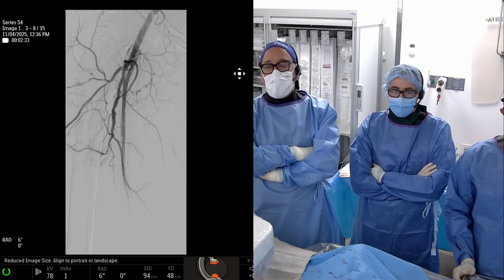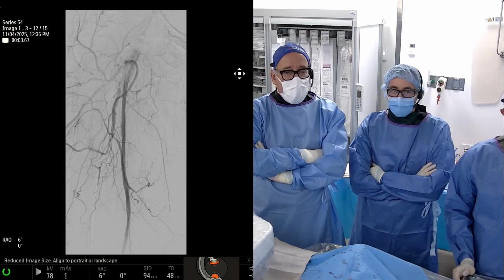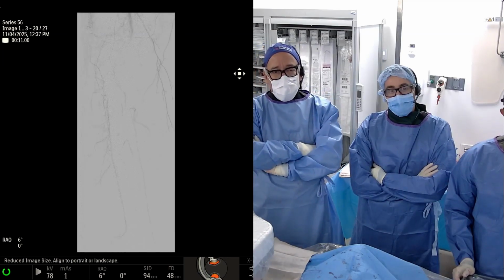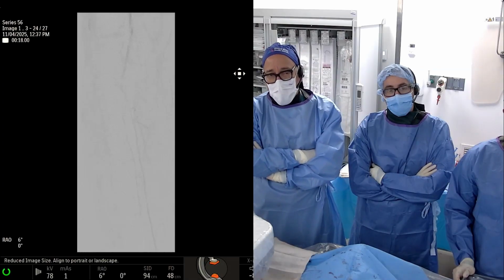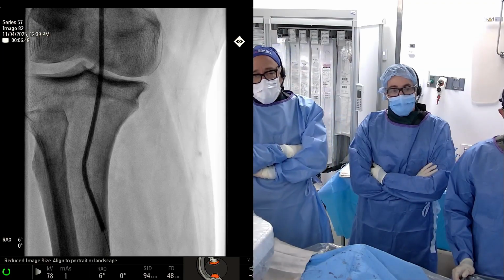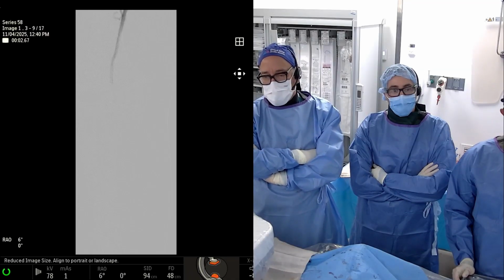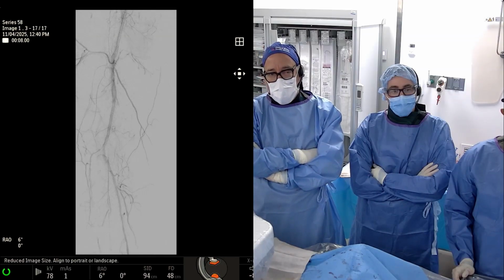Do you want to? Well, we're sort of getting there, and that's where I think is a really good conversation. So this is where we are now, where we've restored antegrade flow. There was some residual material, and so everybody on the panel who said maybe putting a filter down would have been a good idea, they were right. We did not put a filter down, and so we had to chase it briefly off camera. This was a 4-balloon, 4x150 into the PT, which again was our target. And so here we are with restored flow down the PT.